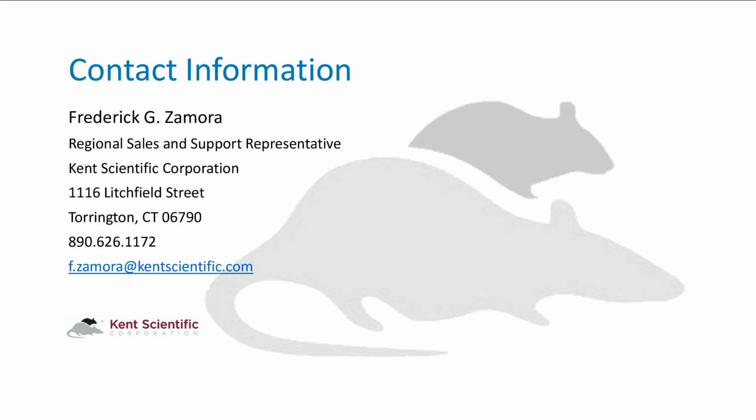Okay, next question. How easy is it to adjust the flow rate in the middle of a procedure? Does the system respond quickly? All right, thank you, Damalola. It is actually fairly easy to adjust the flow rate in the middle of the procedure.